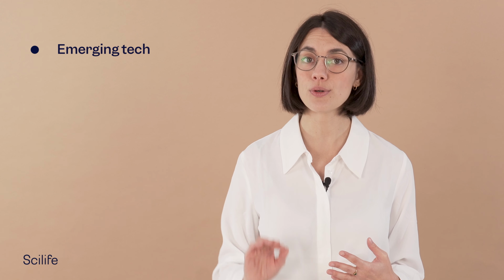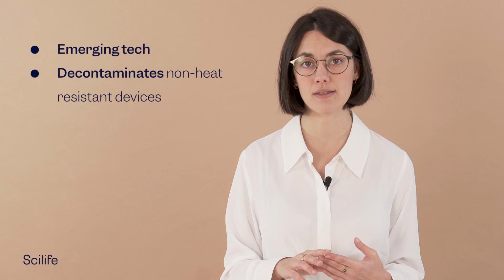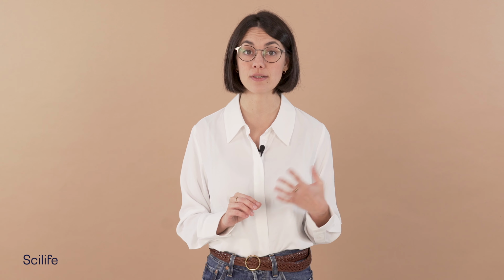Vaporized hydrogen peroxide is an emerging technology for sterilization. It is a low-temperature process useful for decontaminating surfaces of non-heat resistant medical devices. It requires less time than sterilization with ethylene oxide. Once the sterilization cycle has completed, the vapor is vacuumed from the chamber and converted to water and oxygen, so no toxic residues remain. It is a non-toxic, environmental, and safe solution.